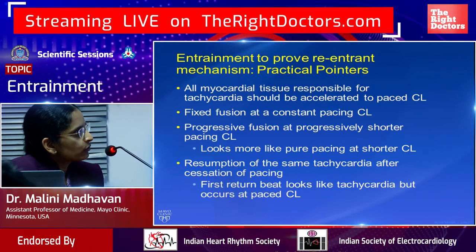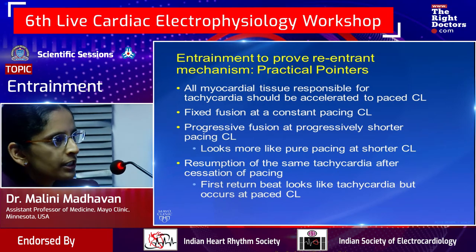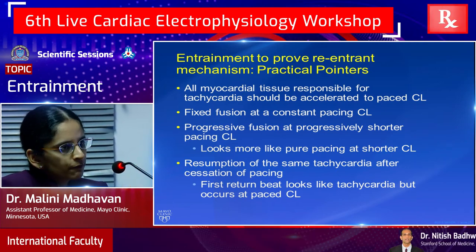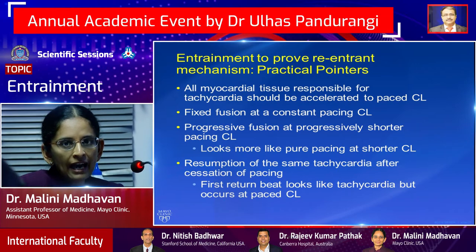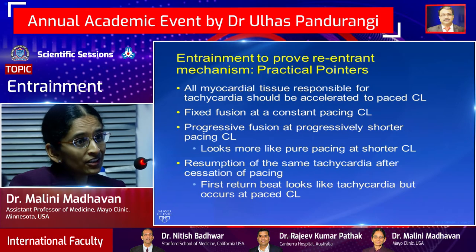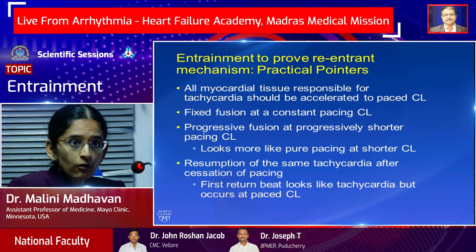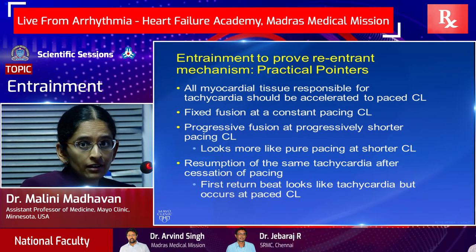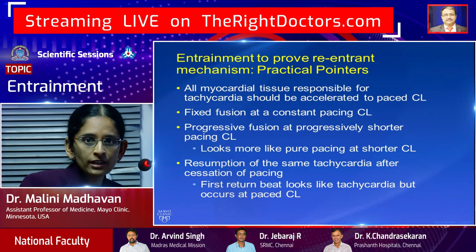And then after that, once you know there is acceleration of the tachycardia, you're going to look for fixed or constant fusion, stable fusion at a constant pacing cycle length, progressive fusion with progressively faster pacing, and then resumption of the same tachycardia after the pacing is completed. So that's another thing. If you terminate tachycardia, or if it comes out as some other morphology after you stop pacing, again, that's not a maneuver that you can really interpret. And typically, you want to see the same cycle length of tachycardia come out as well. So if it's faster after you finish pacing, again, hard to interpret that maneuver.